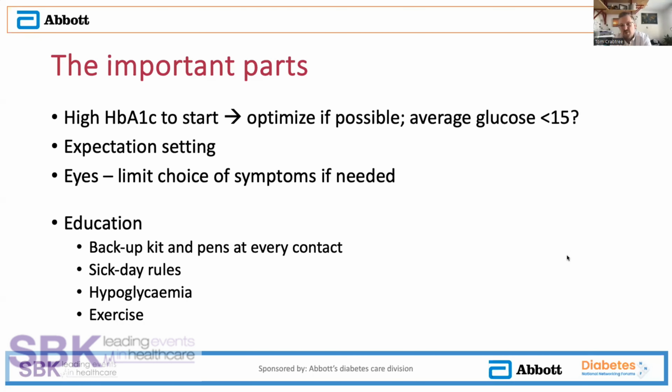And the reason for this is one of the pieces of advice that we give constantly in clinic: if your glucose is more than 15 for 2 hours when you're on the pump, you need to be thinking about, could this be a set failure, giving a rescue injection with a pen, checking your ketones and changing the set. But if your brain is used to seeing glucose levels of more than 15 as being normal for you, then we can say that until we're blue in the face.